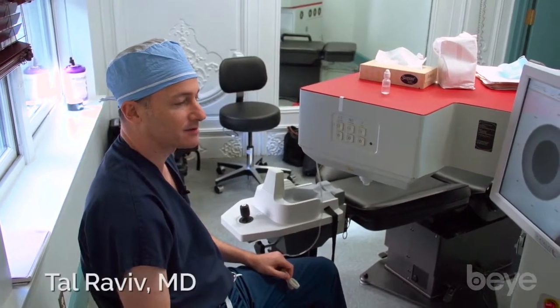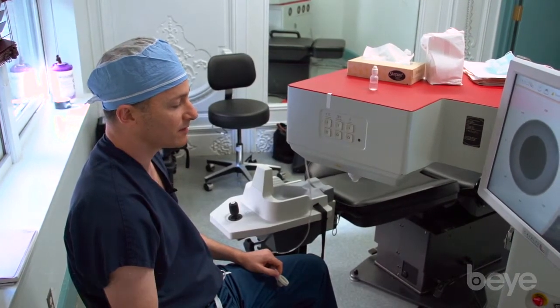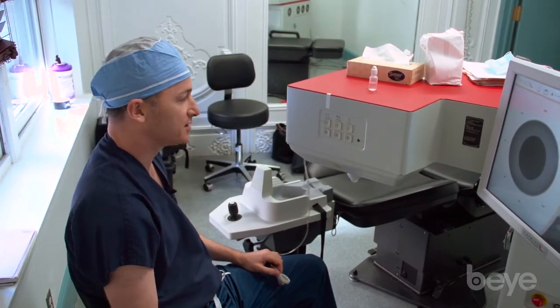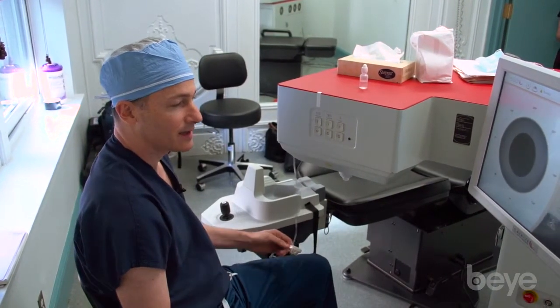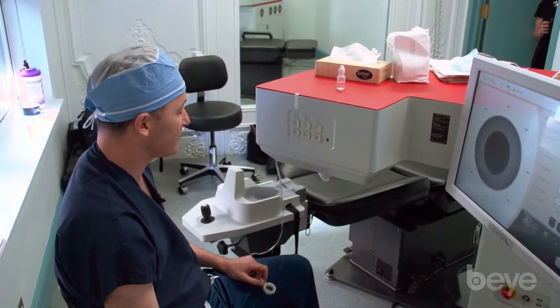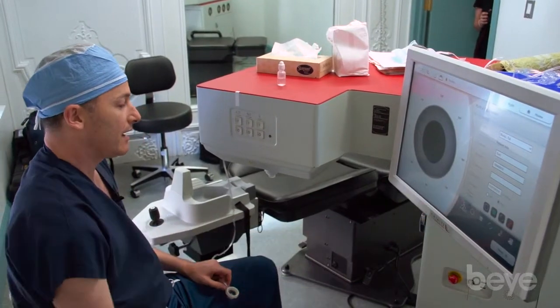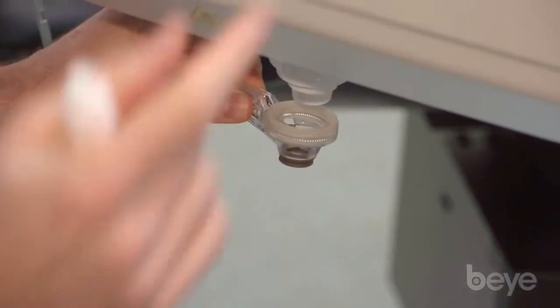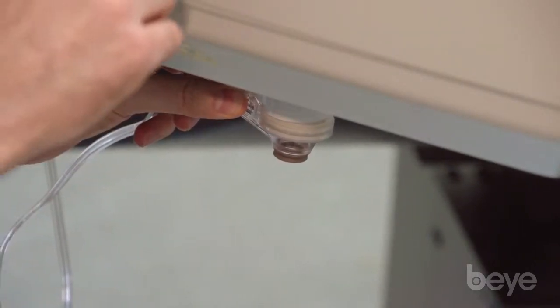This is the Catalyst femtosecond laser unit for cataract surgery. It is one of four machines currently approved in the United States for femtosecond laser cataract surgery. Some features I like include the beautiful user interface and the patient interface, which uses a liquid optics interface that looks something like this.